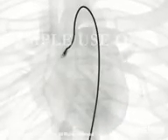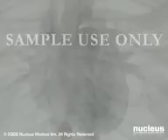You may feel flushed or slightly nauseated when the dye is injected. After sufficient images of both coronary arteries and their tributaries have been recorded, the catheter will be removed through the groin. Pressure must be applied over the femoral artery to prevent bleeding.